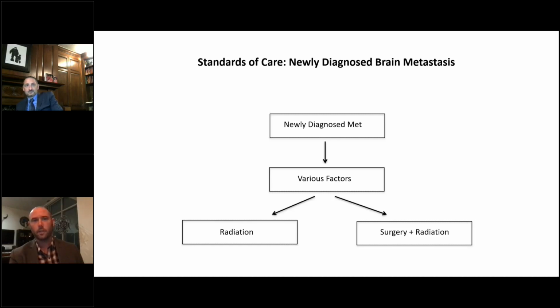I'm still trying to understand for recurrent lesions in particular, where, in an open resection, you're going to have to strip a recurrent tumor off that white matter, and it's scarred, it's radiated. That can be pretty tough to do without getting a deficit for recurrent lesions. Obviously, it's a bit easier for a newly diagnosed MET or GBM. I think you have to be worried about pushing too much heat beyond that border, and you may be a bit more conservative there, just taking the yellow line to the lesion edge against that eloquent border, or something between yellow and blue.